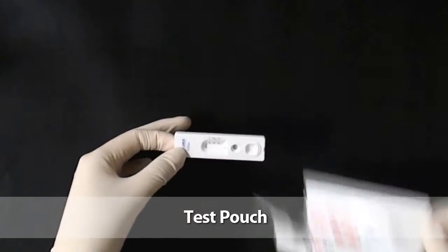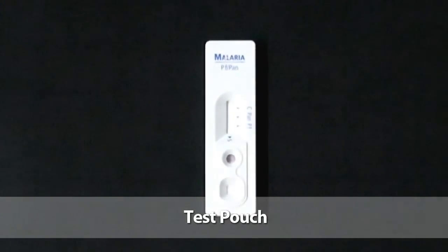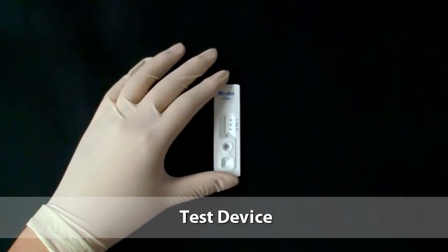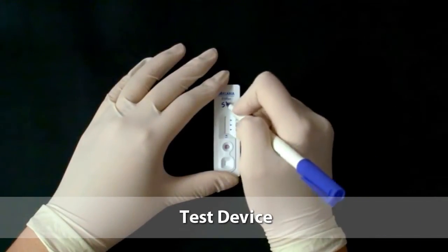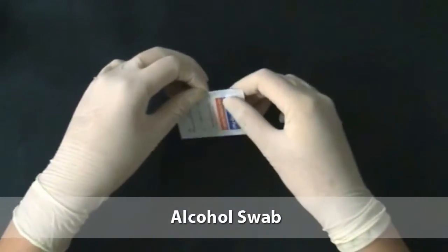Open the test pouch and set out the test device. Write the patient's name on the device. Open the alcohol swab.